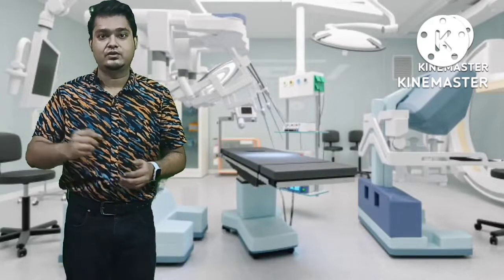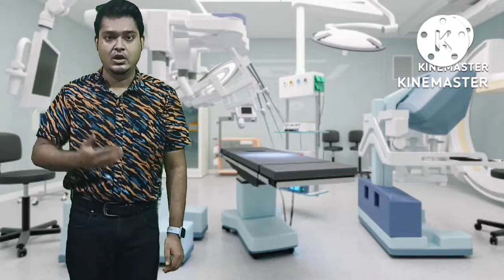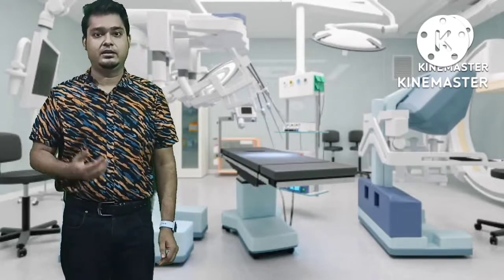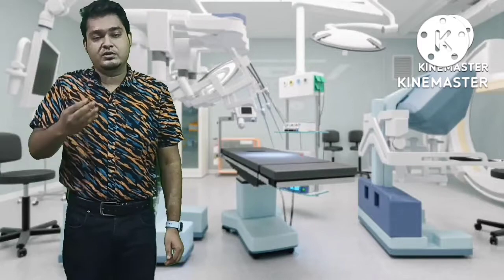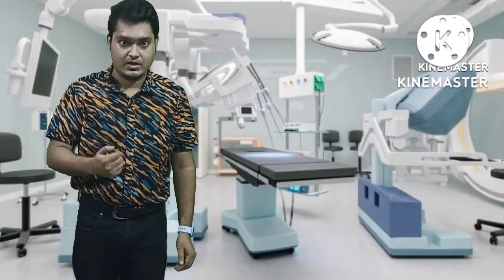Because no catheter is introduced while performing the CT coronary angiography, there is less or minimal or negligible risk to the patient from this procedure. So CT coronary angiography is safer as compared to the traditional catheter angiography.